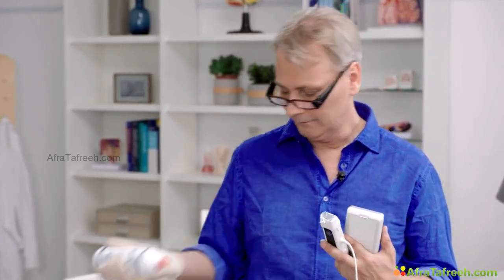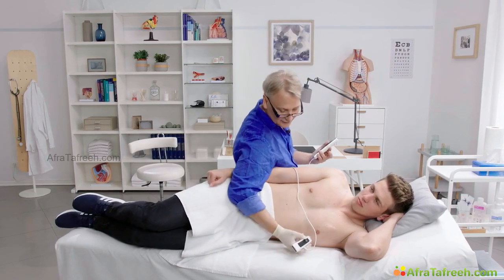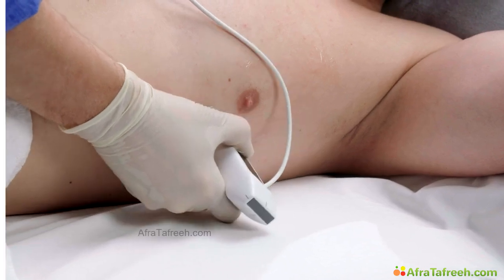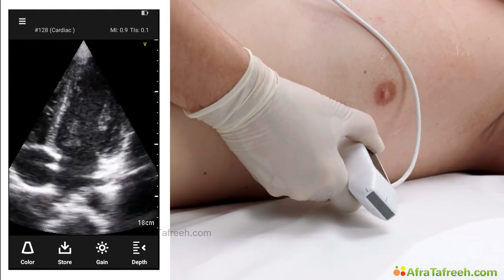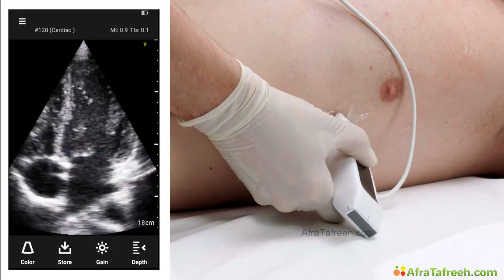So I'll use some gel here. Sit behind the patient, place the transducer at the apex, image upwards, and look for the heart. Now, you have to see the ventricle in your field of view. Play around a little bit, maybe a little bit more lateral or further down caudal, so that you see the ventricle in its full length.